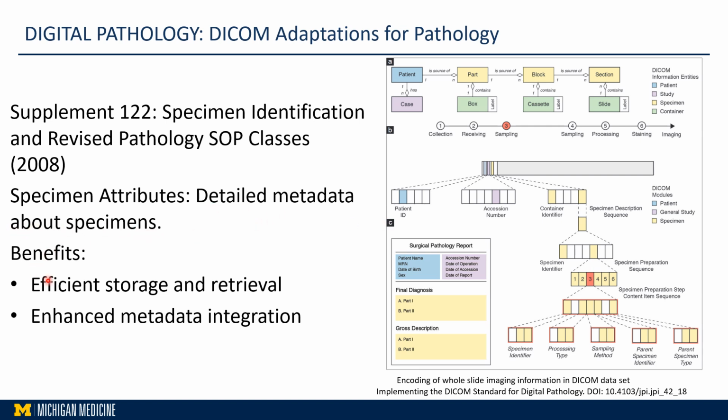The benefits are efficient storage and retrieval, and enhanced metadata integration. Imagine that you have an image that has all the patient metadata: patient name, MRN, date of birth, sex, date of operation, the accession number, date of report.